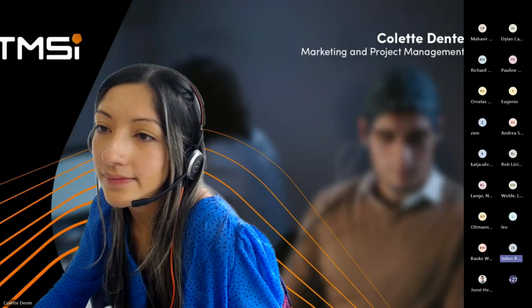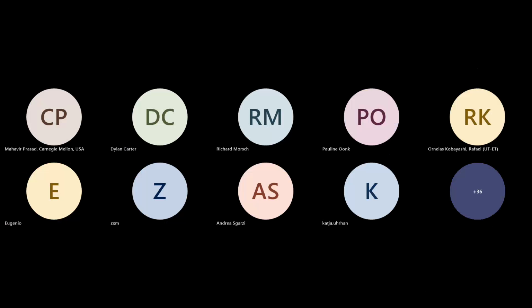So yeah, as I said, it relies on the spatial distribution of your motor units. So it relies on the form of your action potential. So for sure, for example, if you have some fatigue, that will change the shape of your action potential. The separation vector will become more and more outdated, I would say.